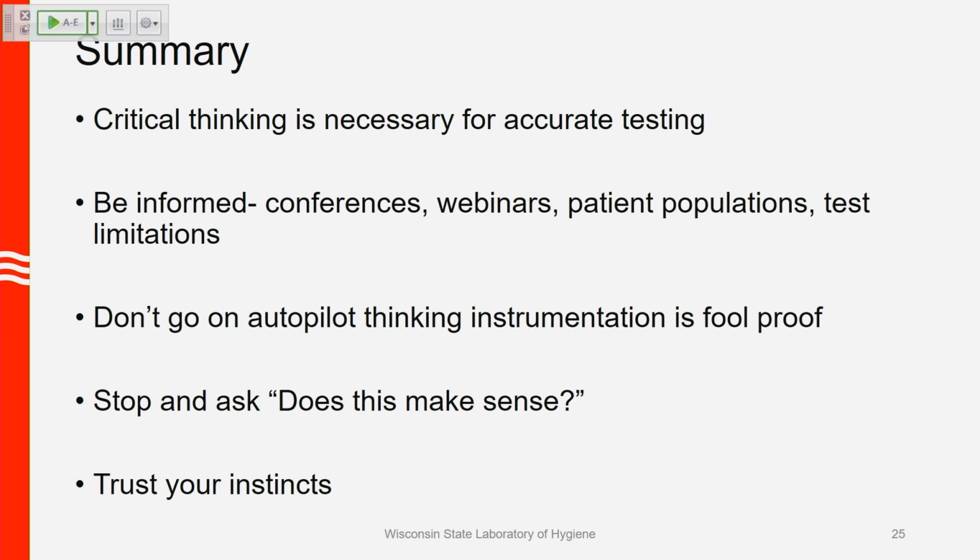Don't go on autopilot thinking the instrument is foolproof. No instrument is foolproof, and no instrument to this date is as powerful as your brain and your ability to recognize these patterns. So stop and ask every time you report a result, does this make sense? And trust your instincts. You guys are all very well-educated, well-informed people. If something doesn't feel right, look into it.